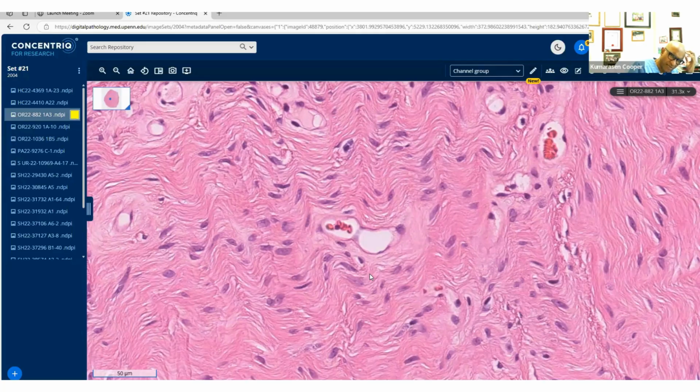So coming back to my differential diagnosis for RB1 loss, right? We've had two tumors, cellular angiofibroma and myofibroblastoma. The other one is spindle cell lipoma. Those are also RB1 loss. They are lost in 50% of pleomorphic liposarcoma, and there's another one I forget now. You can tell me. Somebody can remind us. Okay, any questions or comments?